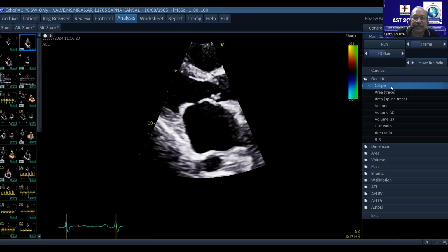That was 1.6 earlier. And this is one point over here and another point over here. This is again 1.6, touch point. Sir, is this the LVOT diameter or the aortic annulus diameter? We always look at what exactly you want to measure. For LVOT diameter, you go 2 to 3 millimeter inside. Let me show how many millimeters: 2 millimeter on this side, 2 millimeter on this side.